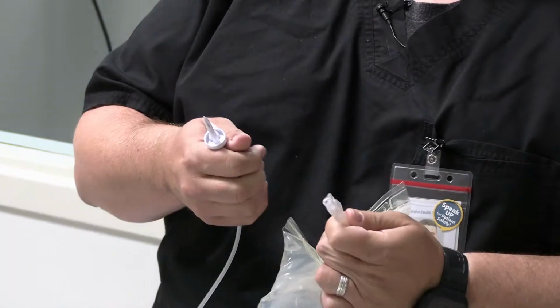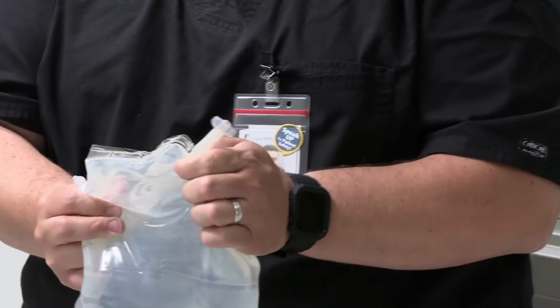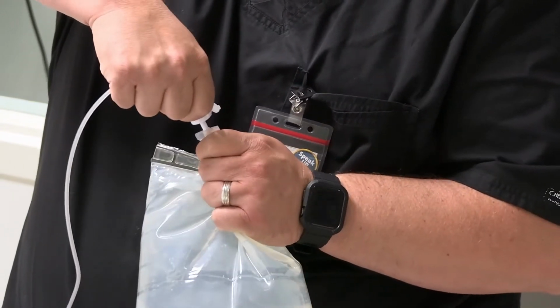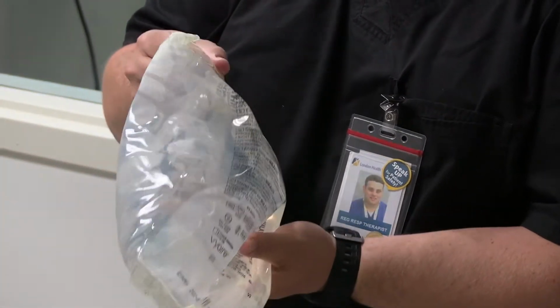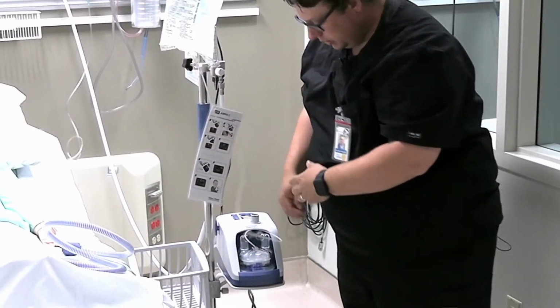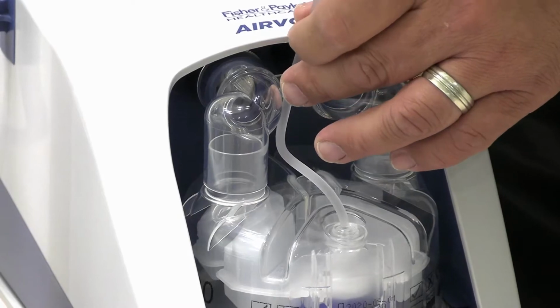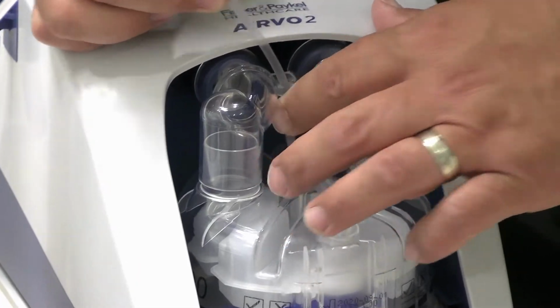Remove the tab from the water, just like so. And then holding this, just gently insert your spike into the water bag until it punctures through. Try not to puncture through the side there and accidentally poke yourself. And then you're just going to hang your bag of water here, and what you'll notice is you'll start to see water fill into your chamber. And then just take your fill line, and in order to keep things sort of neat and tidy and out of the way, you're just going to push your fill line through this little hook on the device, just like that.